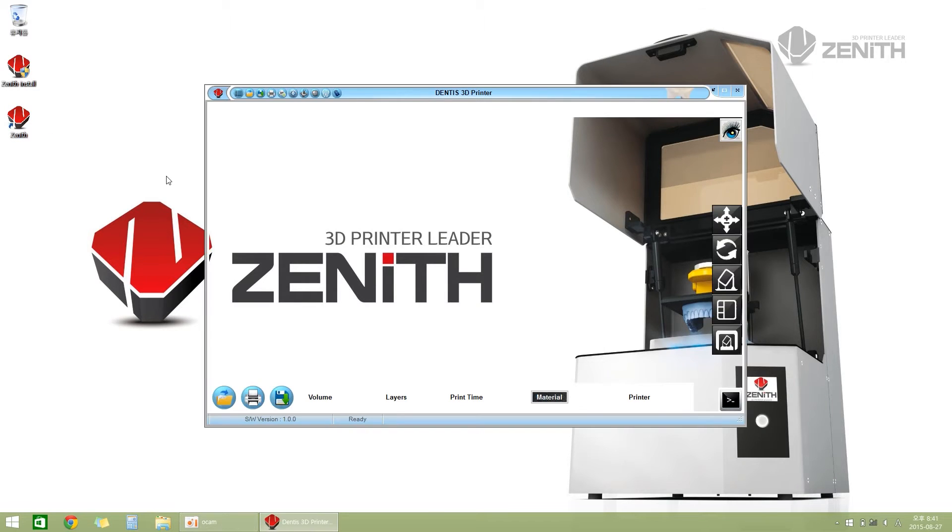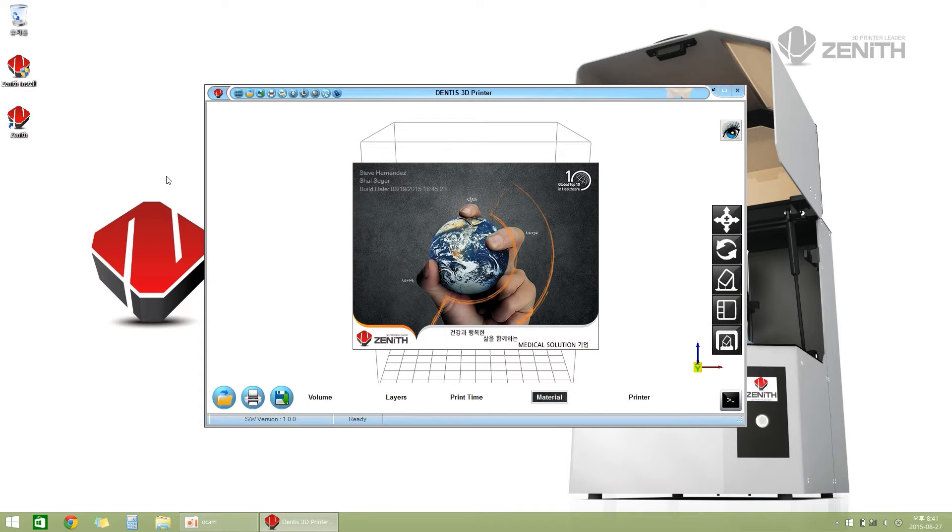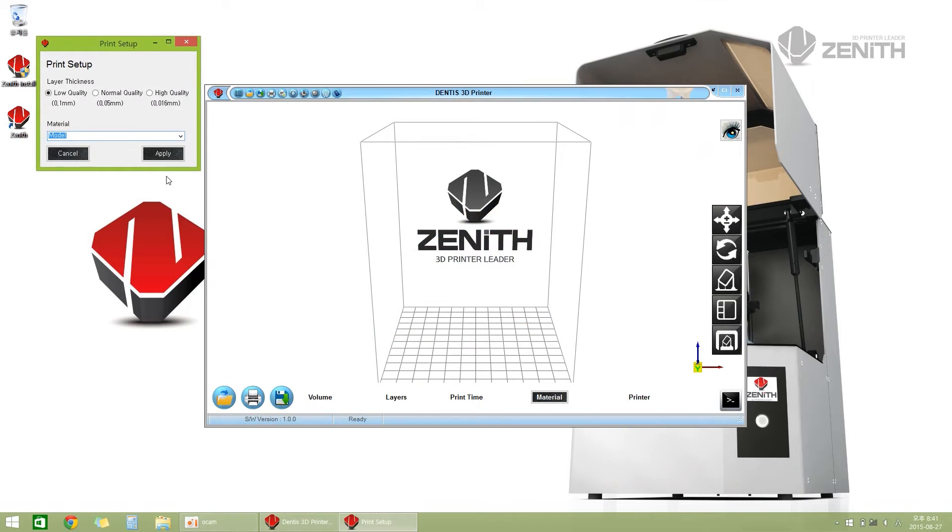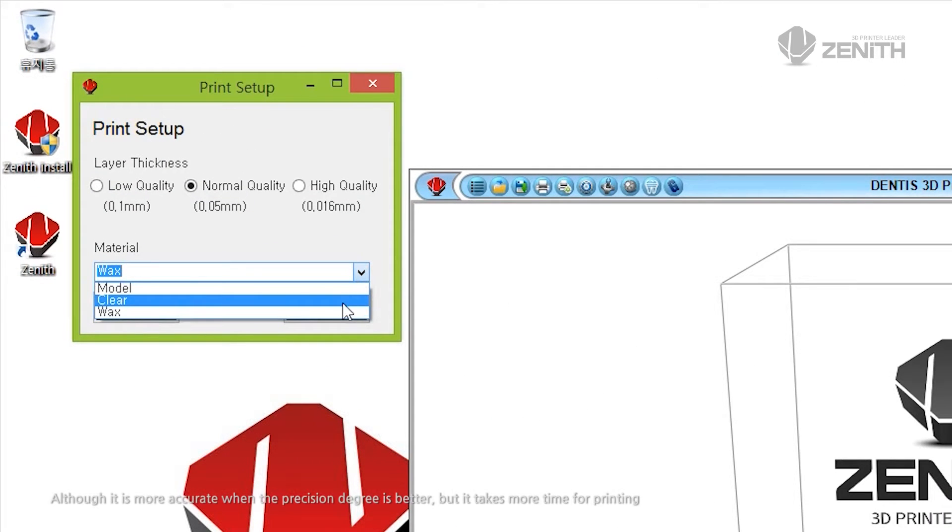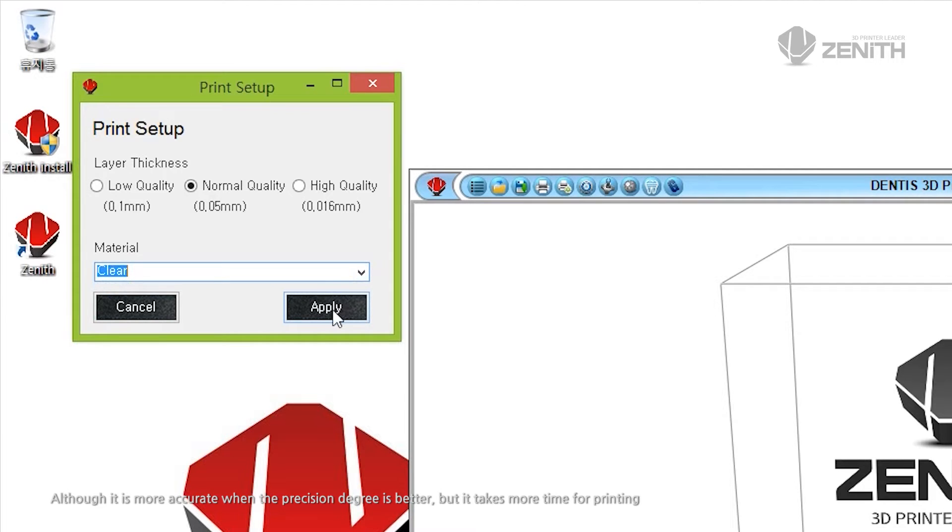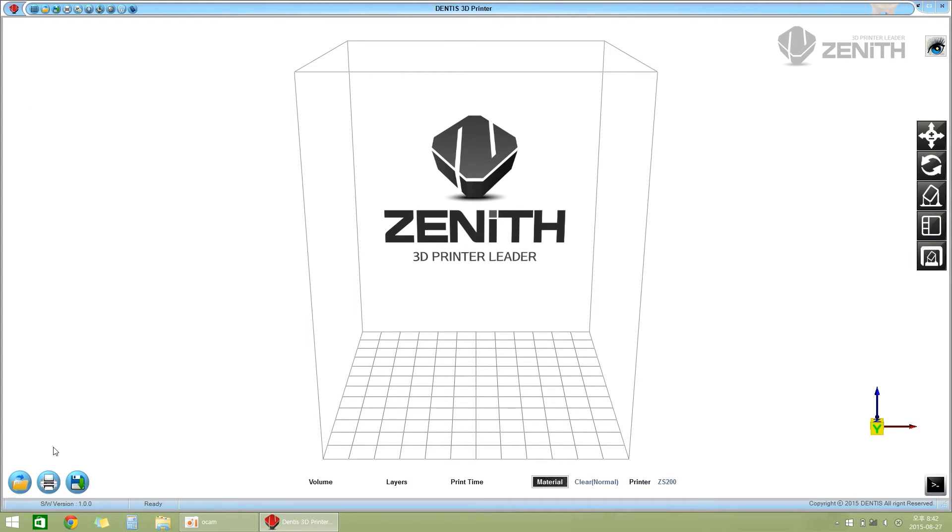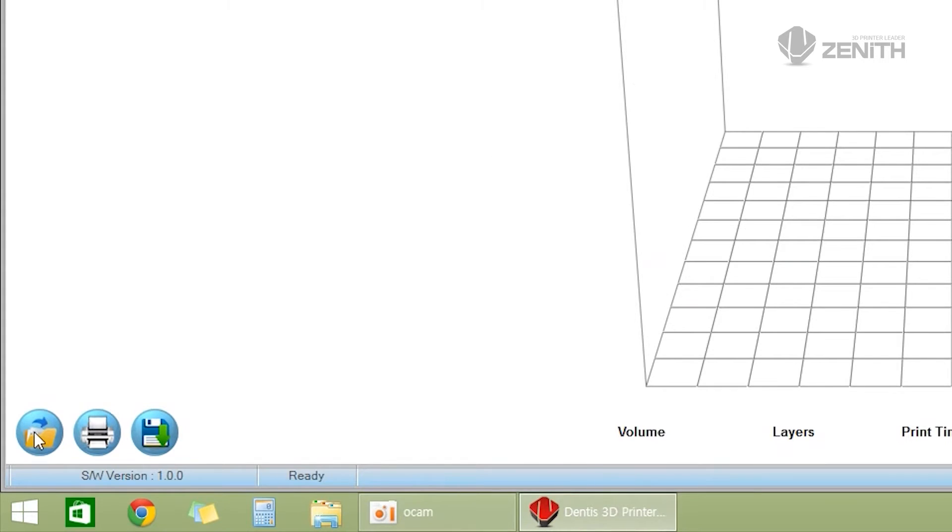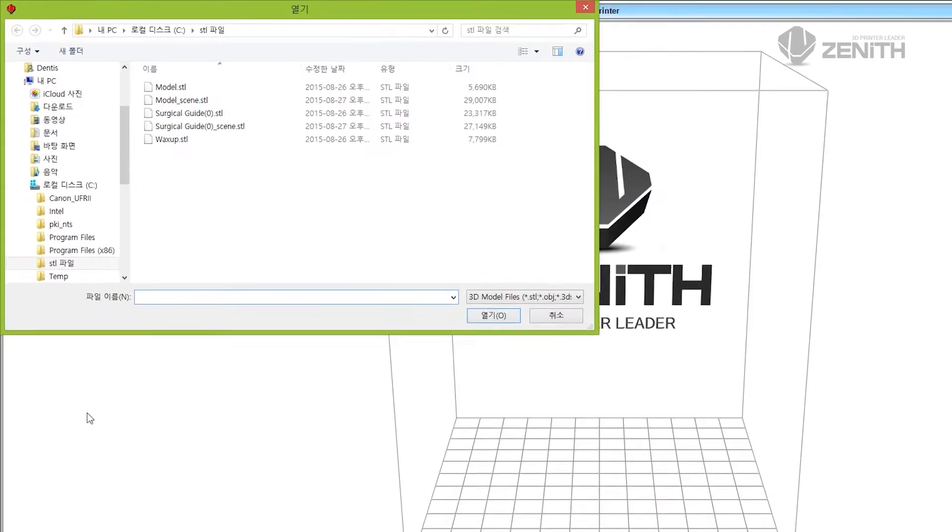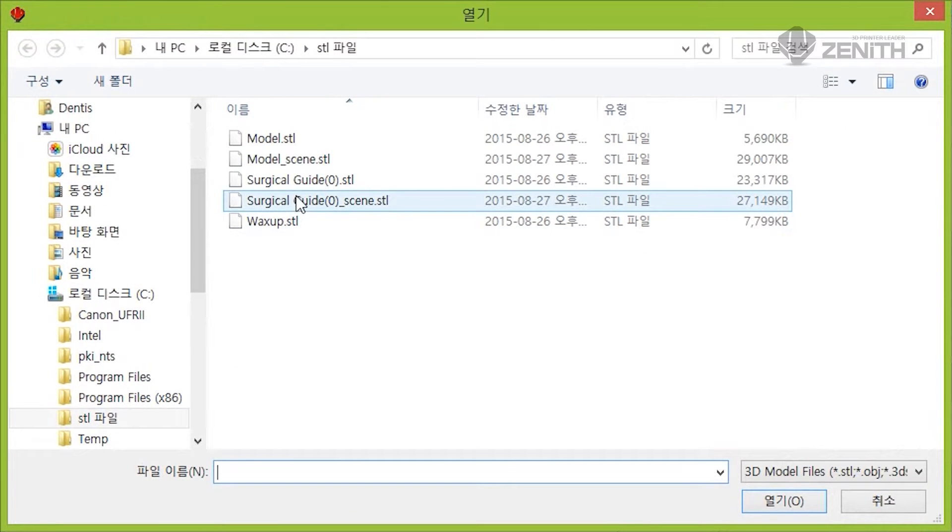Select precision degree from the layer thickness menu and select materials from the material menu, then press the apply button. Push the import button in the left bottom to select the STL file to be printed out.